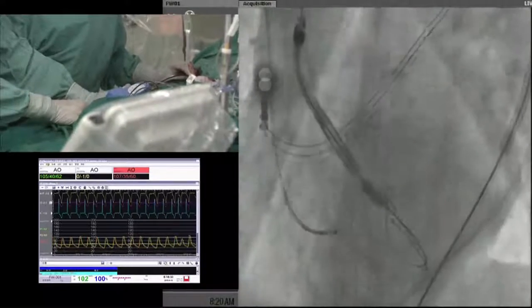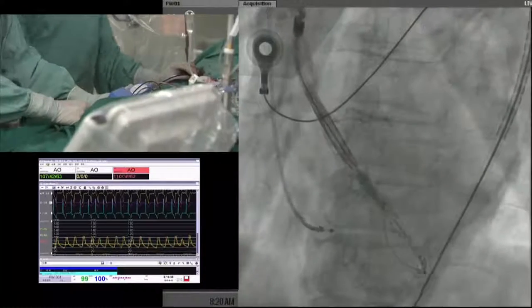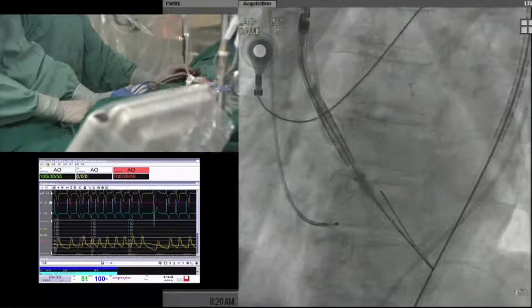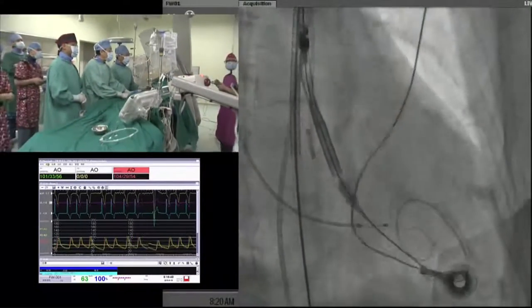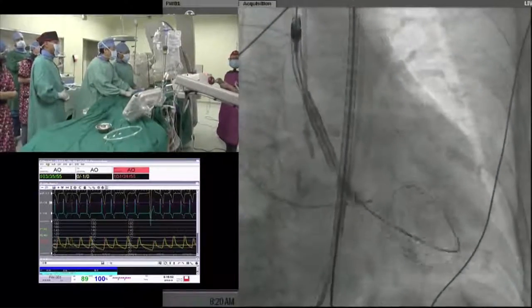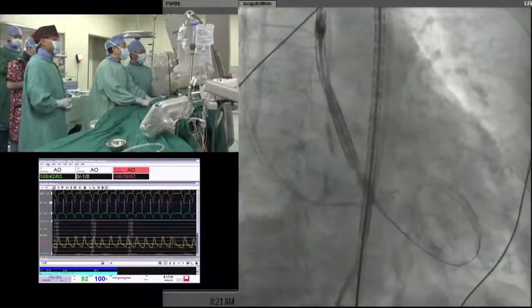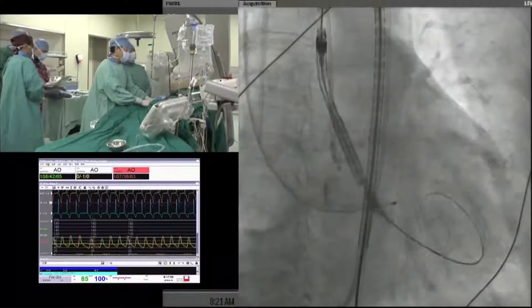So you align the camera to be perpendicular to the valve? To the ring, yes. As the blood pressure is stable, we're going to do the double S curve to make sure which is best for the projection plane. This is the technique developed by Nicola Piazza, getting both perpendicular to the implantable valve and also the native valve. Because Piazza is the proctor for this trajectory, it's okay.